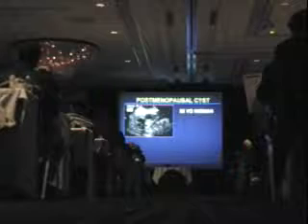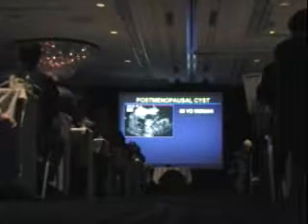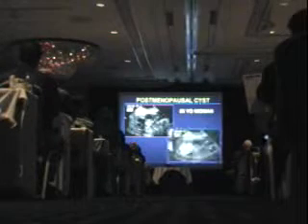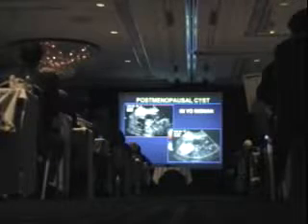So let's start with a postmenopausal woman. What do I do when I have a postmenopausal woman and I see what looks like a small cyst in her ovary? The first thing I would do is put color on. Make sure that ovary is avascular. Look very carefully at it.